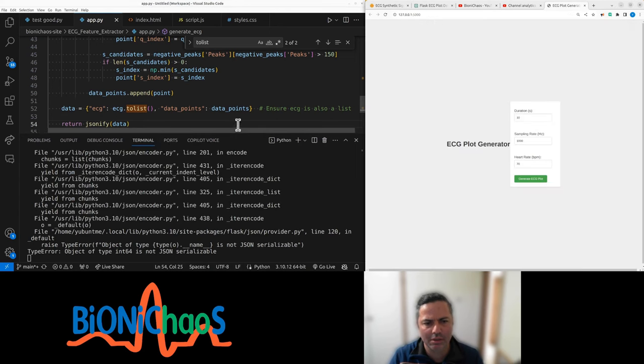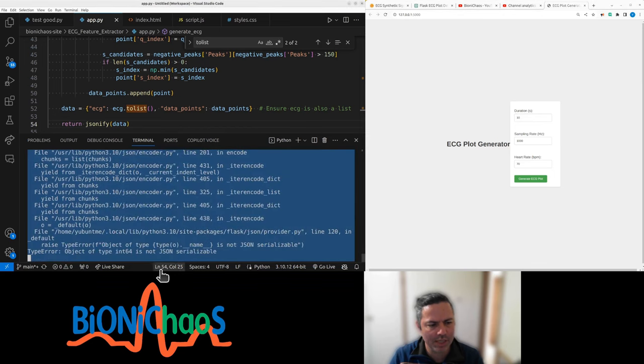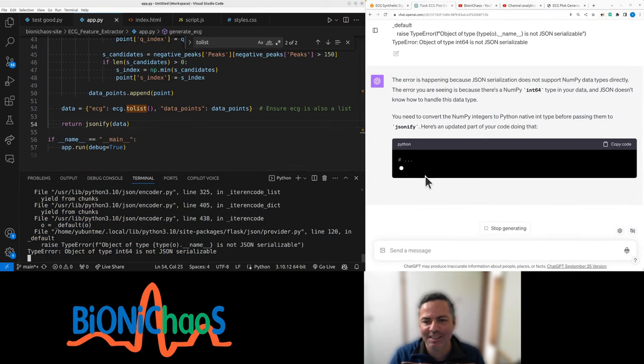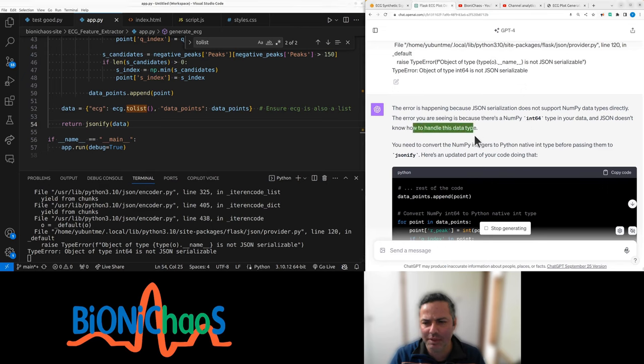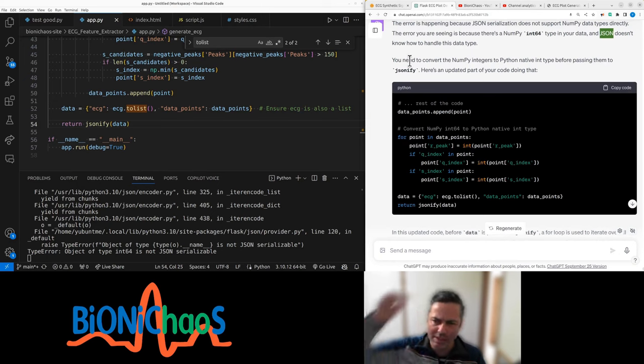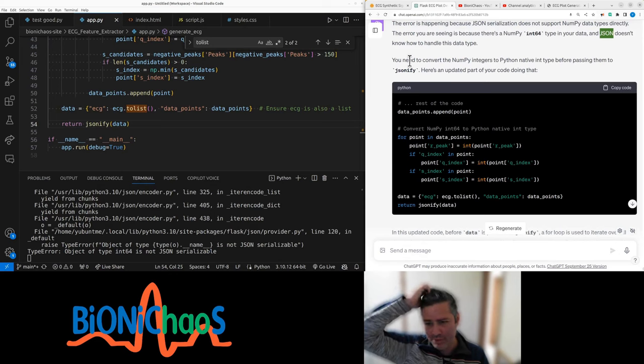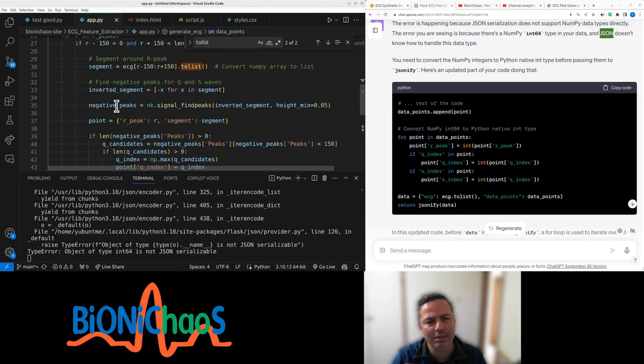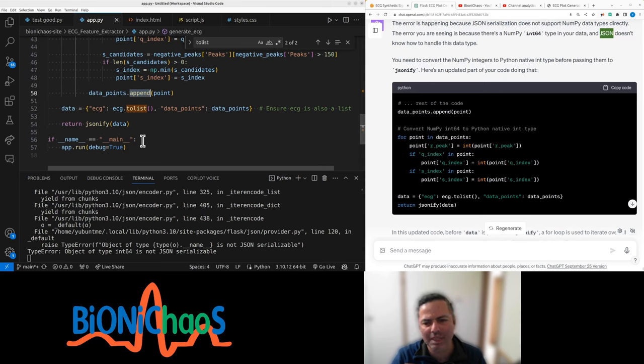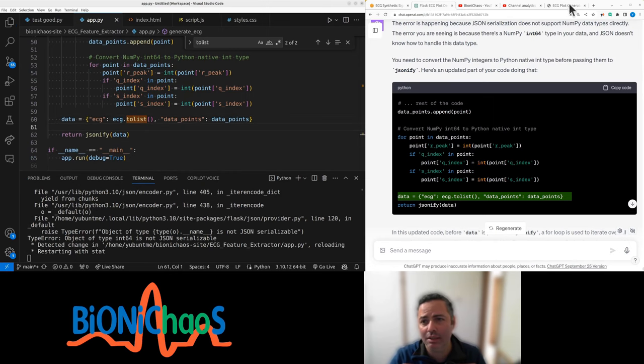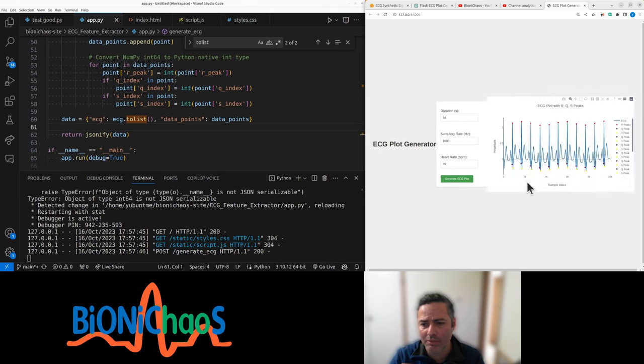Still getting an error. It's a long one. Traceback. Let's see, because there's numpy, numpy int64 type in your data. JSON doesn't know how to handle this data. We had similar problems before. You need to convert the numpy integers to Python native integer type before passing them to jsonify. Data points, and jsonify data. Now it's working.